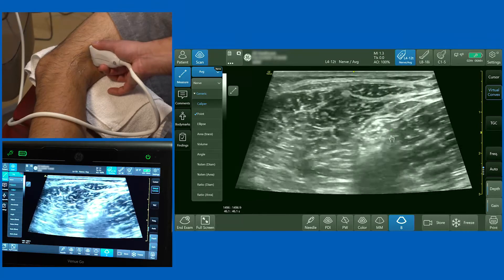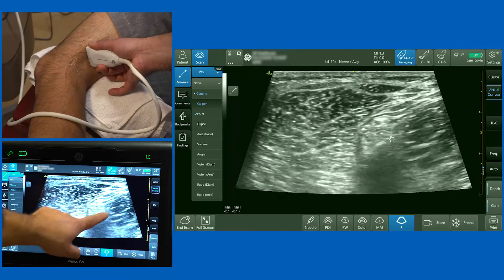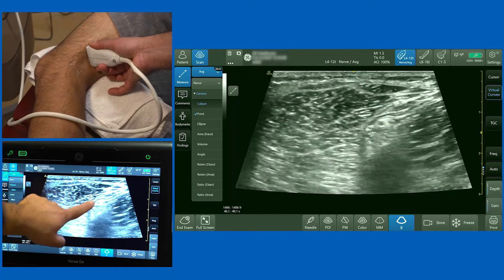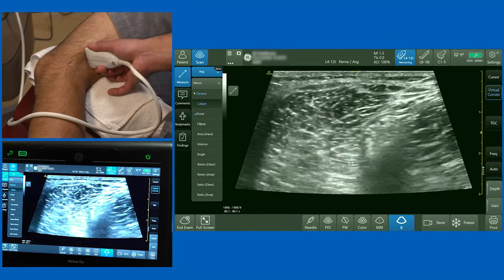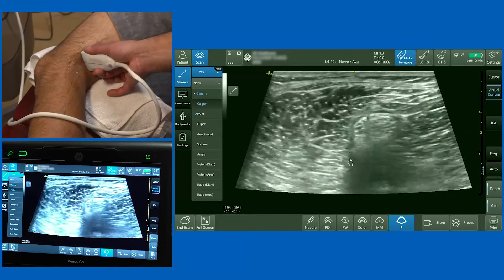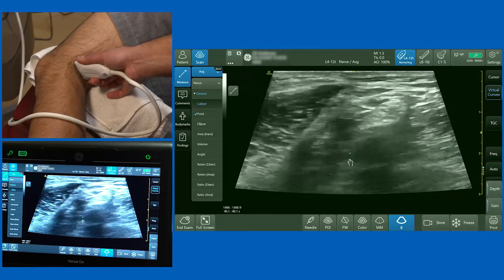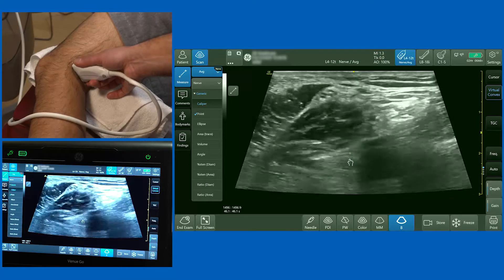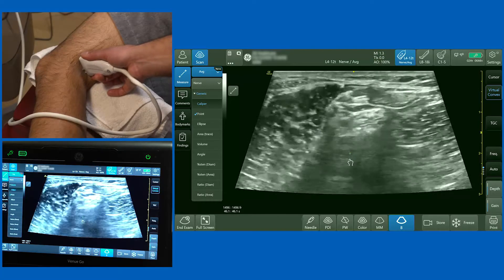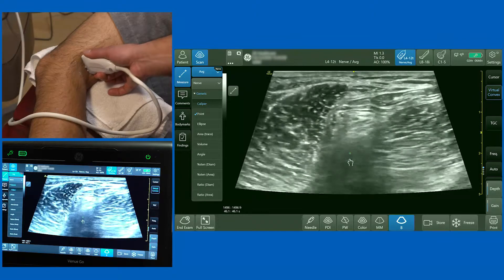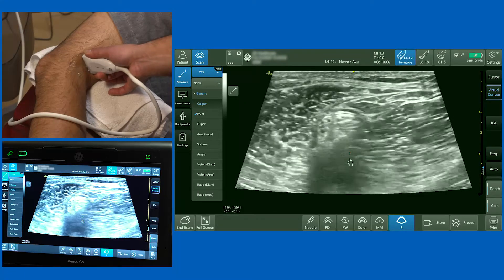You can see a very classical nerve appearance — this honeycomb appearance surrounded by the common sheath. As I scan back down the leg, you can see the nerve separate very beautifully. Here the two nerves separate, and here they come together — this would be a good place to block the nerve.